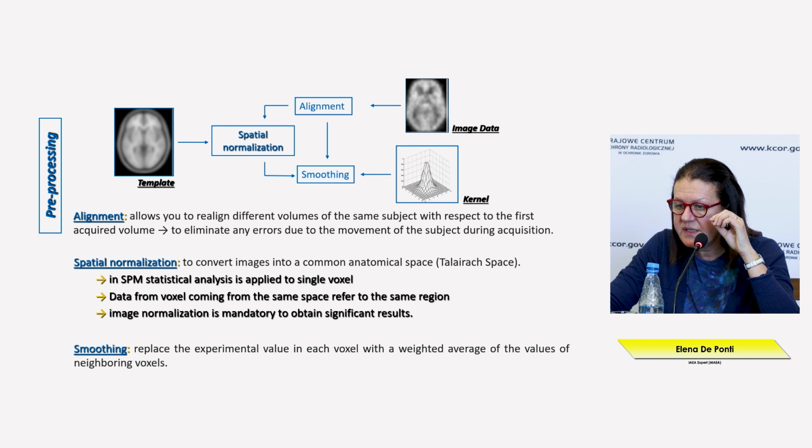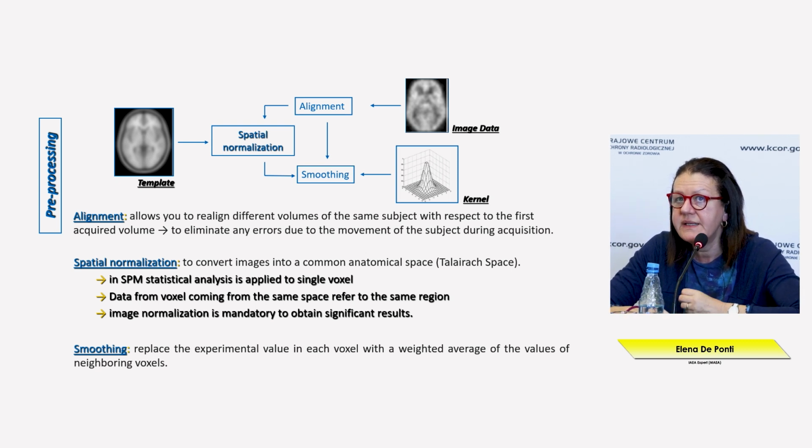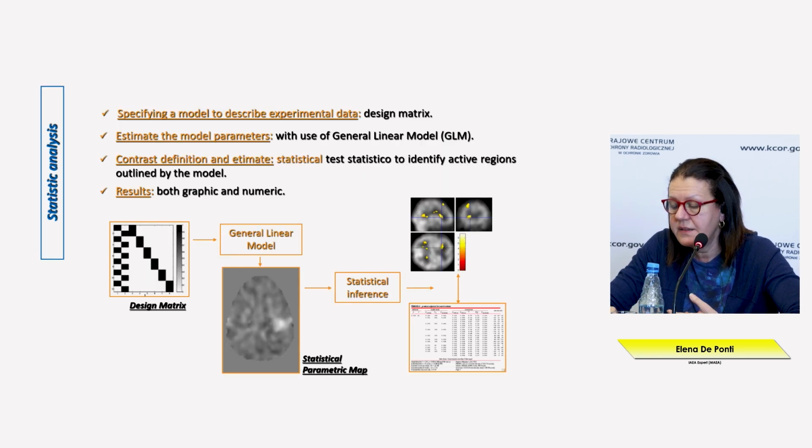The purpose is to replace a manual definition and a manual visualization of those areas of the brain that have an abnormal signal with an automatic tool.